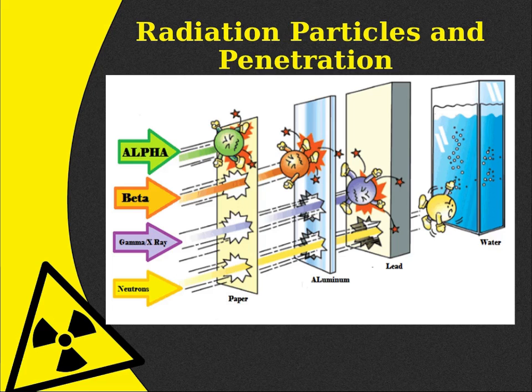The last and most powerful type of radiation is neutrons. Fortunately, in the diagnostic range, neutrons would not be produced because it needs energy of more than 10 MV to be produced. And to stop this, we need around 25 centimeters of water or wax and boron. It's a combination shield to stop the neutrons. So we don't have to worry about it in the diagnostic range.